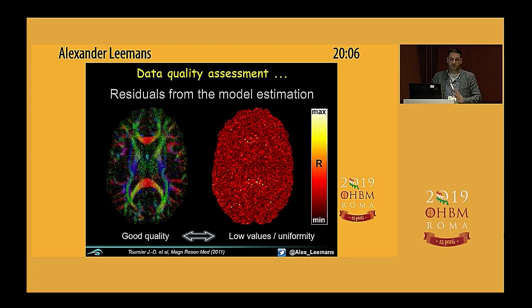So in this case, the model is DTI, the same as the slope, and the little white lines from the previous toy example are basically the differences between the diffusion-weighted measurements and the diffusion-weighted signal as predicted by the diffusion tensor that we've estimated from our data, right? So the diffusion tensor is basically these 6 components.